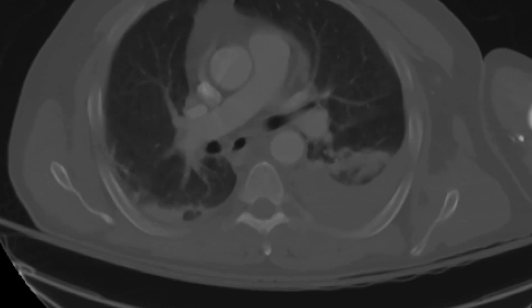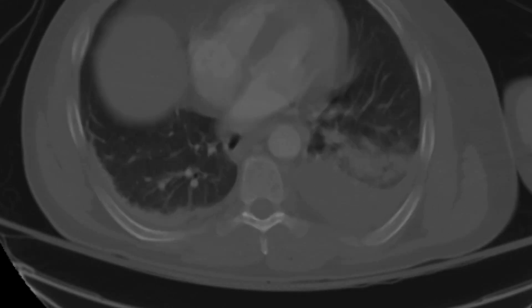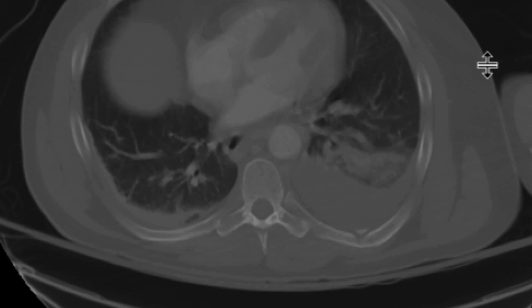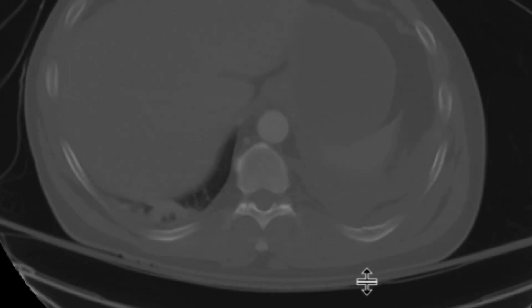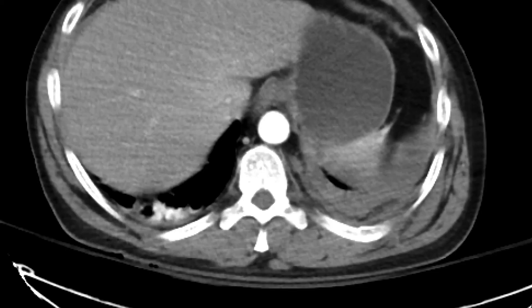We can certainly see that there's a whole bunch of osseous injuries here, including significant bilateral rib fractures. We can see one over here. And the left ribs — several of these — we can see another one over here.